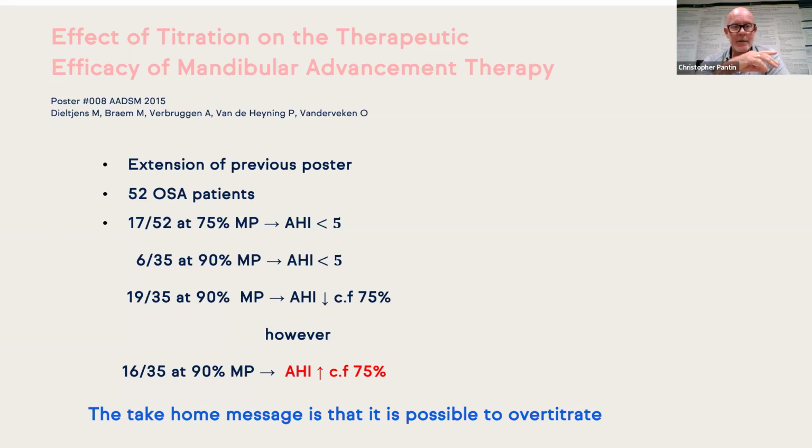Now, when you've been doing this work for a long time and you see things like that, you say, well, thank God I'm not stupid, because I have seen this clinically so much, patients over-titrating, and then you wind them back and they actually get an outcome. So just be very aware of that, hence also why protruding as far as you can isn't necessarily a good titration protocol.